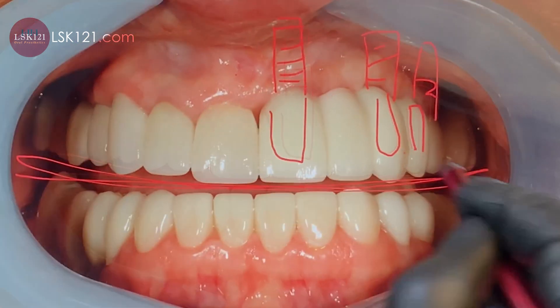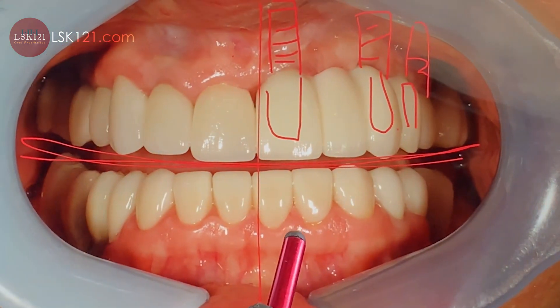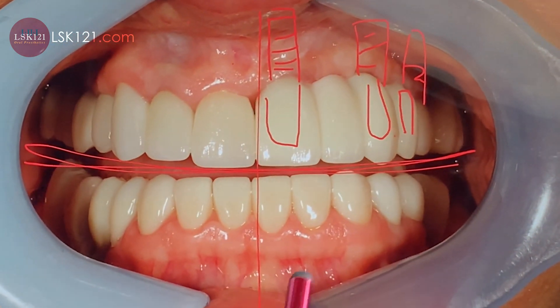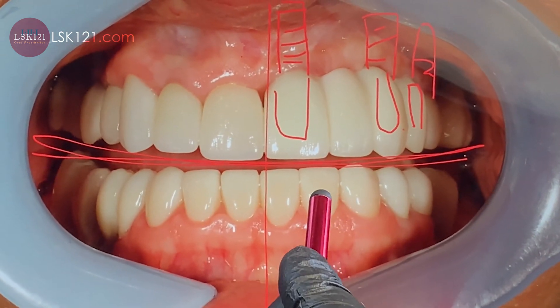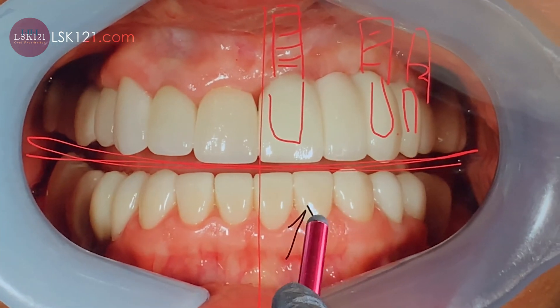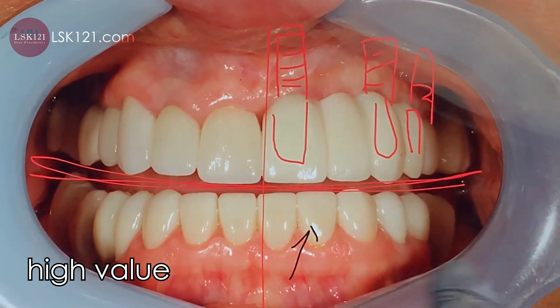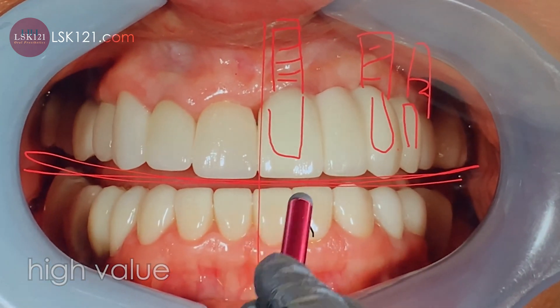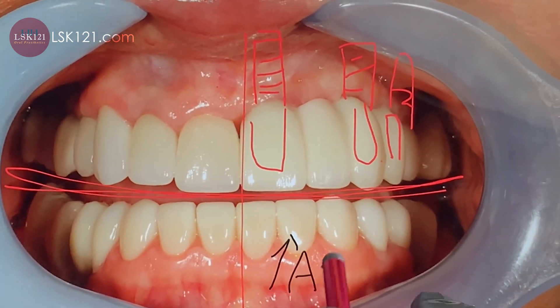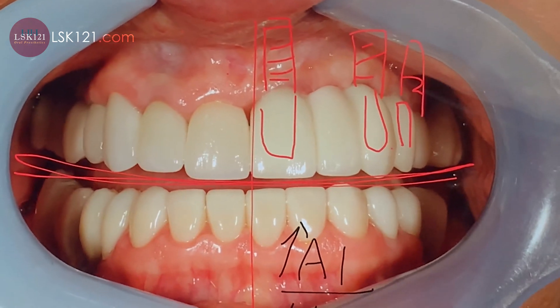The midline is good. We finished the lower, and I noticed a little discoloration after cementation. I call this high value — meaning it's really sticking out, very reflective. I have to follow one color type, not 1M1. There's a slight color difference.